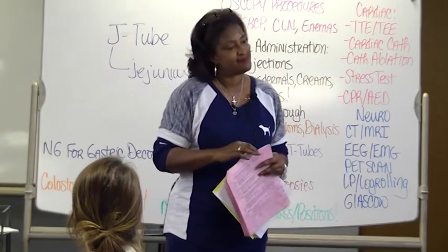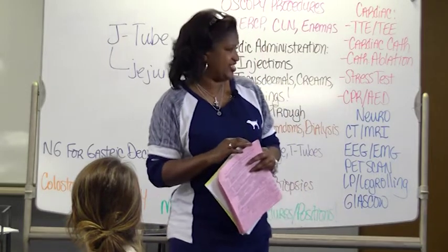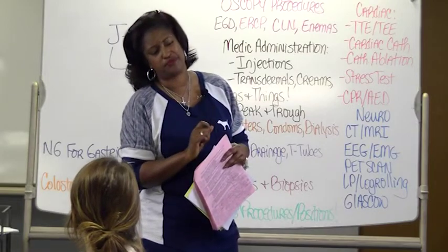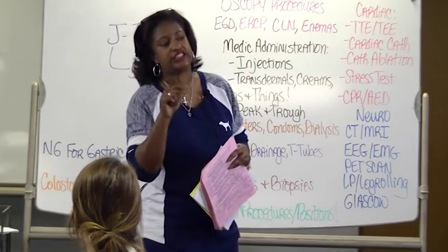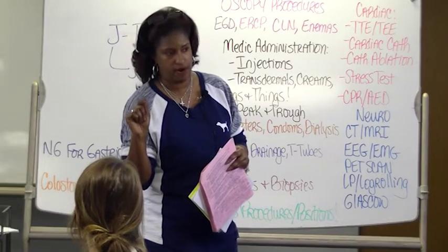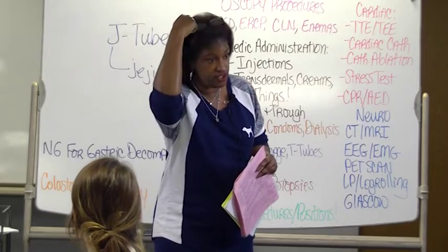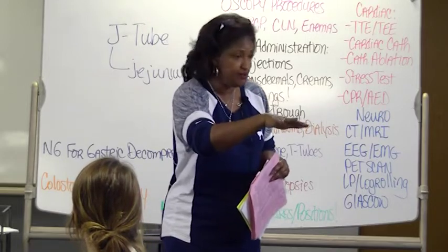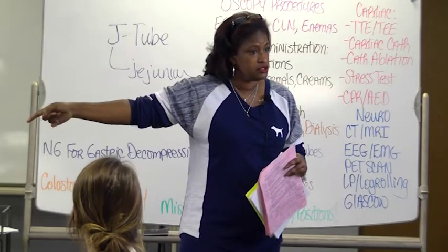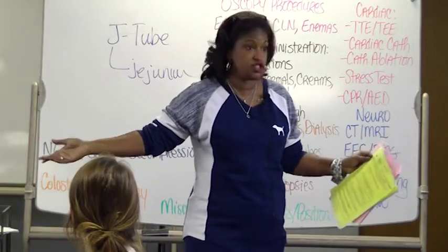Wouldn't that raise the ICP? Well, how about we kill the patient when we put NG tube feedings in their brain? ICP is the last thing we have to worry about. How about we killed the patient when we put an NG in their brain? No, I'm not saying this is non-sterile. This is sterile. Screw ICP. You've got a bigger problem. You killed the patient. It's not an issue of ICP. It's an issue of dumbness.